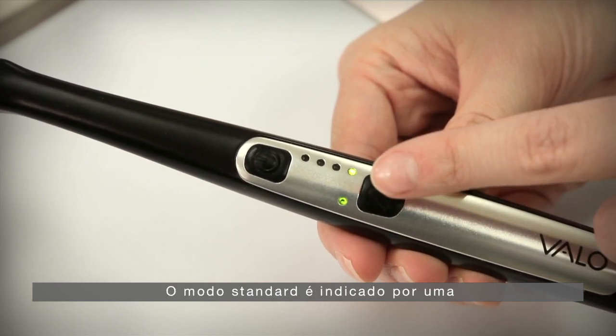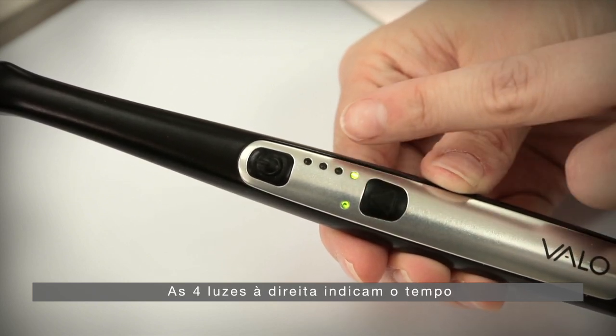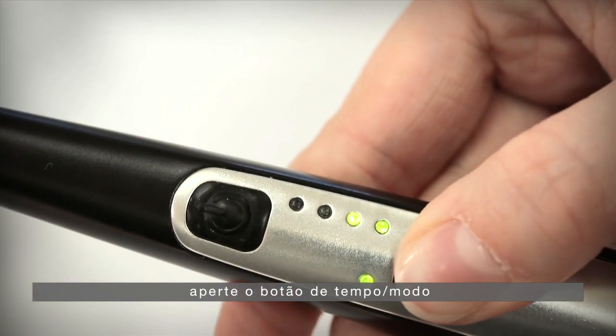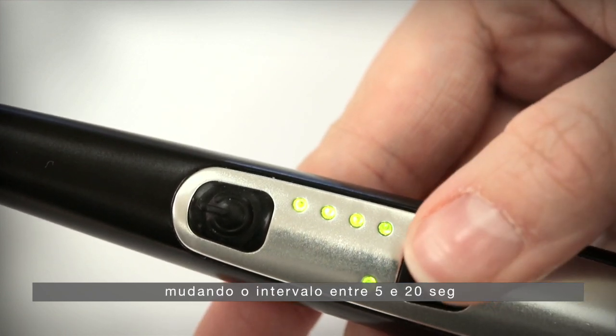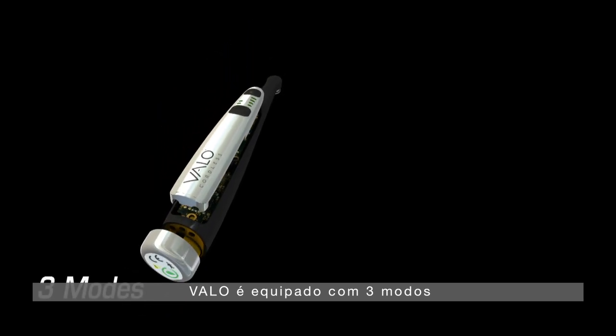Standard mode is shown by a solid green light on the left of the panel. The four lights on the right represent the time. To change the time in five-second intervals, press the time and mode button. The beep and illuminated lights will change with each press of the button, cycling from five up to 20 seconds.